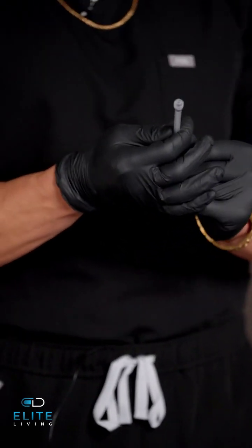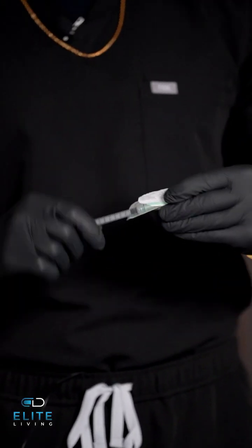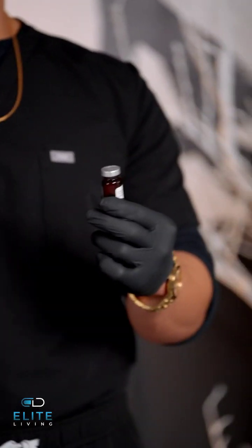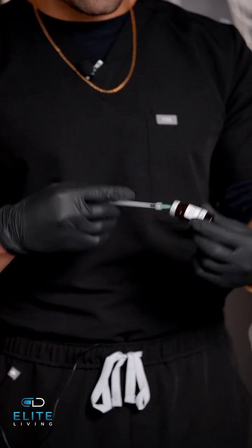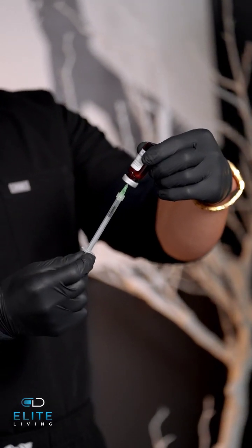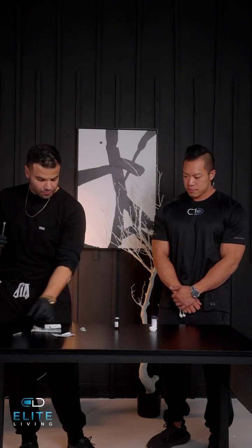Next, we'll take our syringe, and like I said, we will first start with the 21 gauge to draw the medication. Take the top off, and we're going to be doing one cc. Here it says one milliliter — one milliliter is also equivalent to one cc, and as I mentioned before, we will be administering vitamin D today. You're going to simply pull back, let it flow, and make sure there's no bubbles. We will now dispose of this needle and use the 25 gauge.